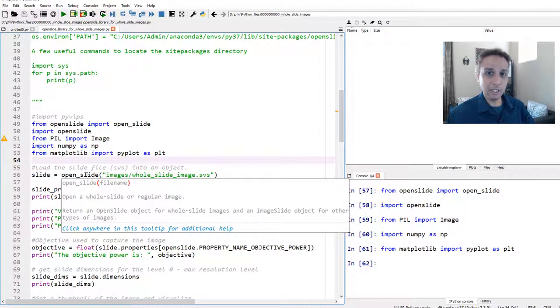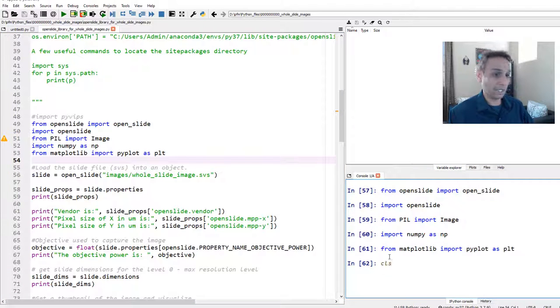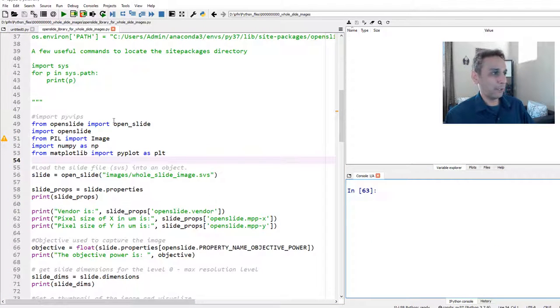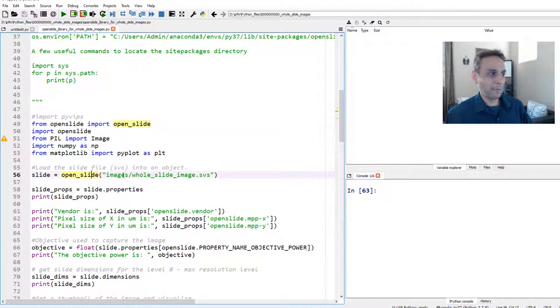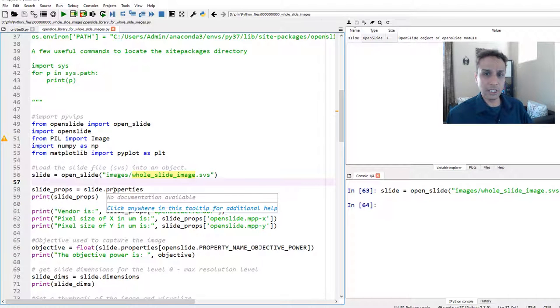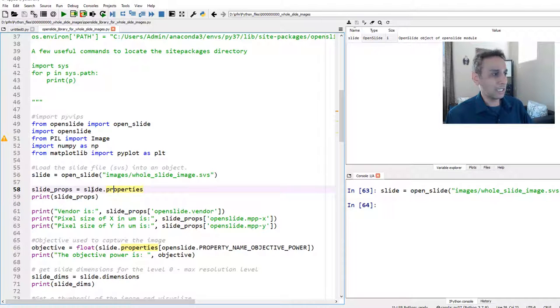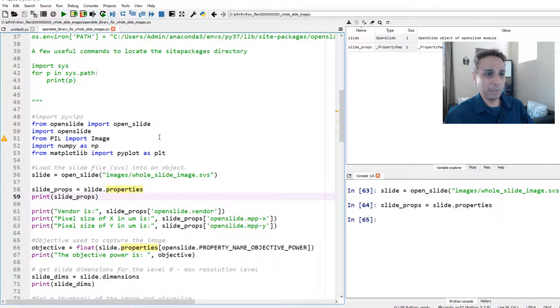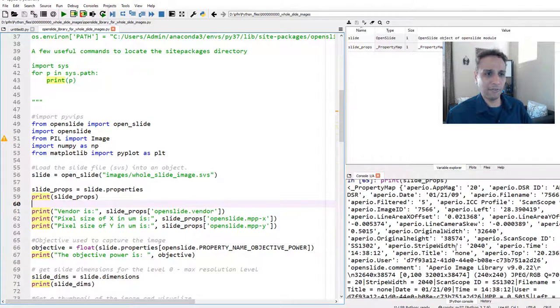Now let's open a slide — not an image, but a slide. I downloaded an SVS file (about 643 MB) by searching for sample SVS files online. In reality these can be tens of gigabytes. To open it, use open_slide() and provide the path to your file. The result is not a NumPy array — it's an OpenSlide object containing many things. We can start by extracting its properties with slide.properties to see what's stored.